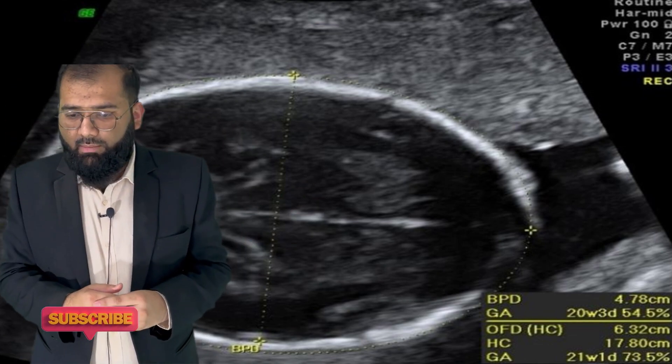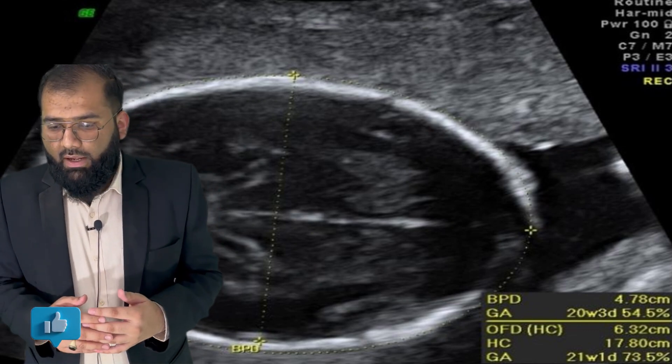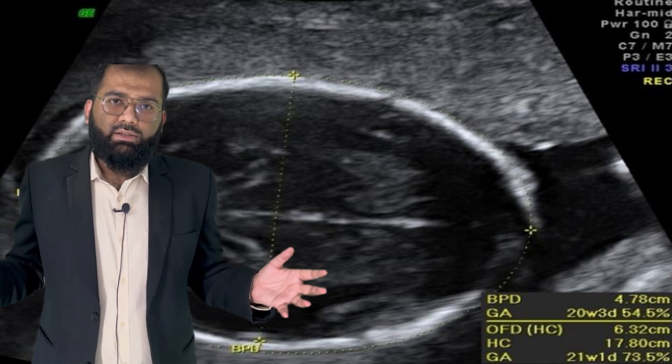Here in the image you can see that BPD corresponds to 47 mm, corresponding to 20 weeks and 3 days. Thank you.